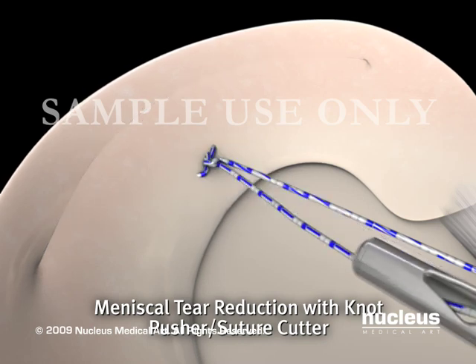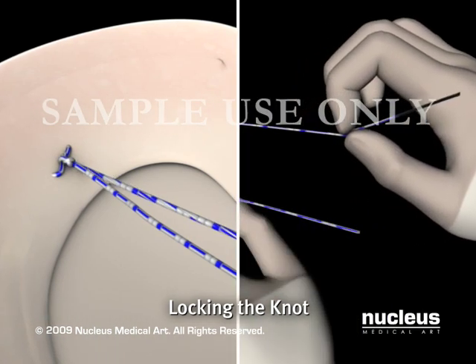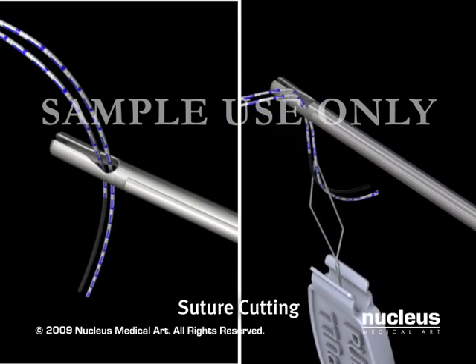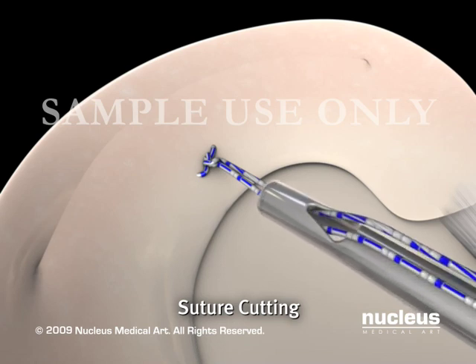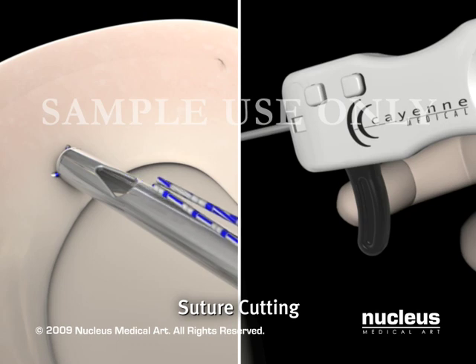Once satisfactory reduction is achieved, the black free end of the suture is pulled to lock the knot into position. Half hitches can be added at this point as required. In preparation for cutting the suture, both ends are threaded through the CrossFix knot pusher suture cutter. The knot pusher suture cutter slides down the suture onto the knot, and the tip rests against the knot, allowing for a 2-3 mm tail. Pulling the black trigger cuts the suture.